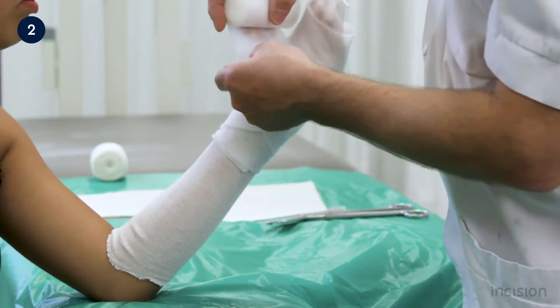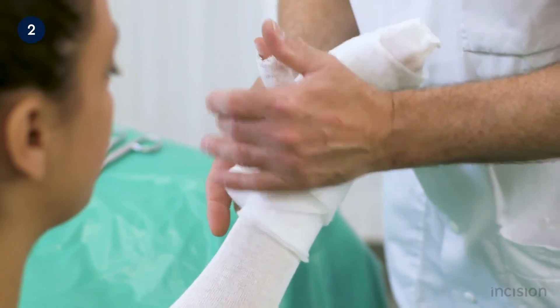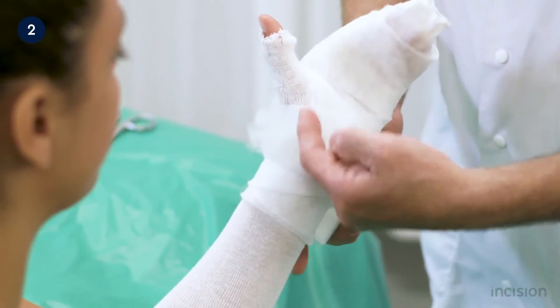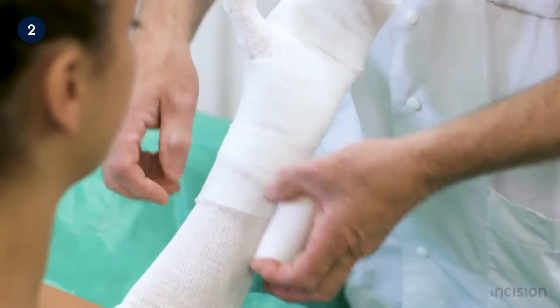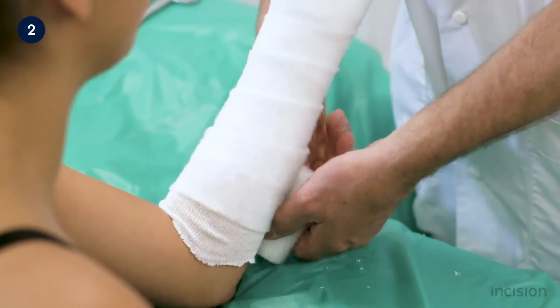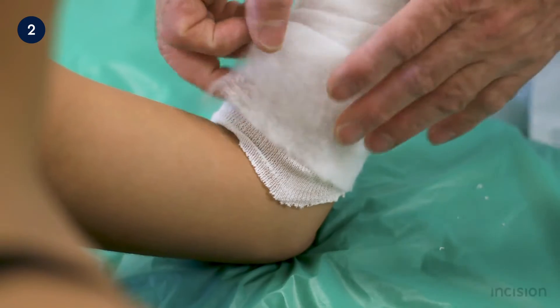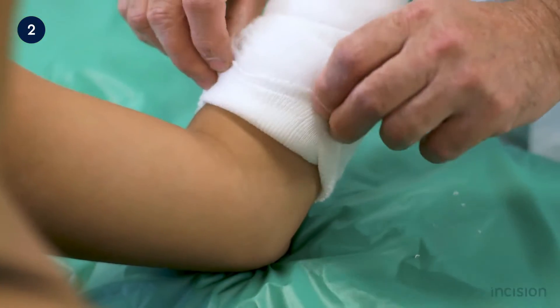The padding is then rolled into the first web space and proximally along the forearm, with each turn overlapping the preceding one by 50 percent. Note how the stockinette is left longer than the padding proximally, allowing folding and protecting the skin from sharp edges.